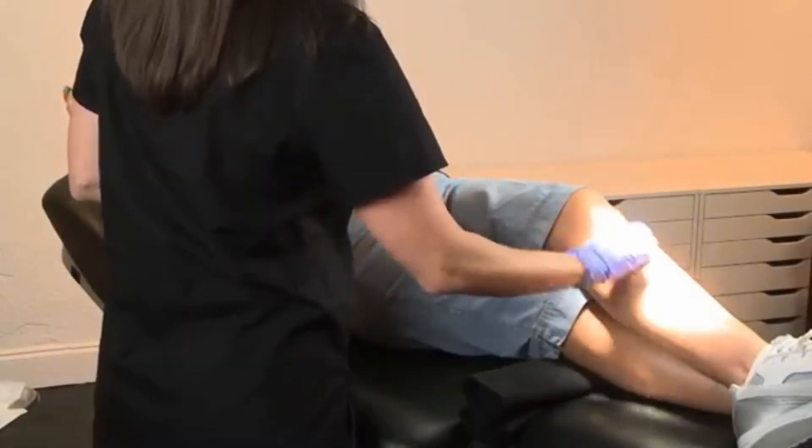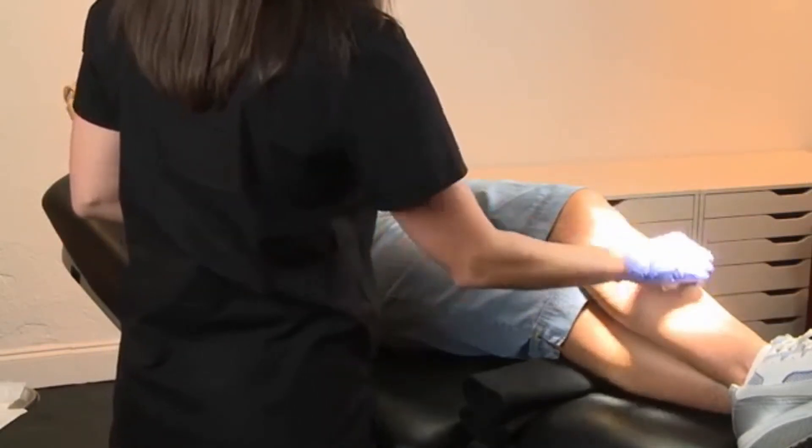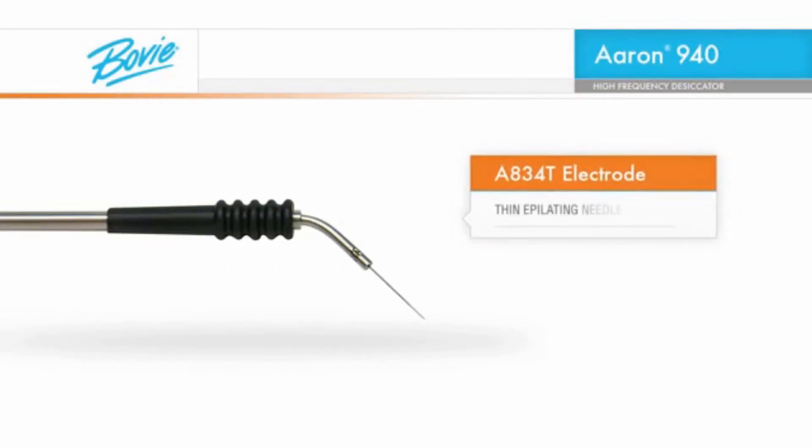Prior to commencing the procedure, prep the treatment area with a topical antiseptic. For hair removal, we will be using the BOVI A834T electrode, a thin epilating needle.